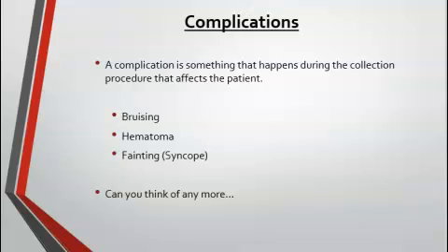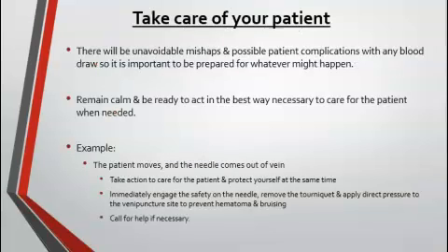And there's several complications that can happen during a phlebotomy draw. Of course, there's the possibility of bruising or a hematoma or your patient fainting. As a lab tech or a phlebotomist, there's going to be unavoidable mishaps or possible patient complications with blood draws. But it's important to be prepared no matter what happens. As a professional, you need to remain calm and you need to be ready to act in the best way to treat your patient. If the patient moves, remove the needle from the vein.